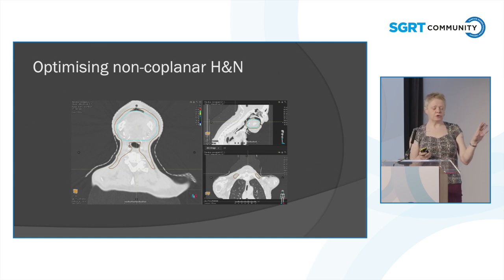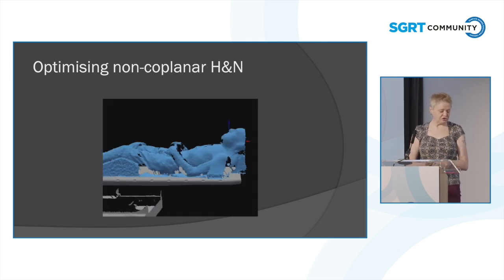So I thought, you know what? Let's just try and see if this works on this patient. The consultants were for it, the radiographers were for it, with going for the couch kicks. So, yeah, we just decided to go for it.